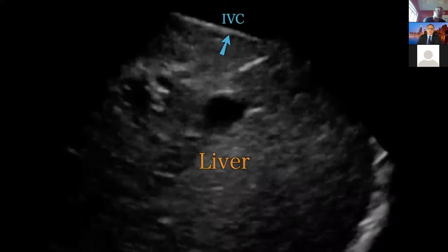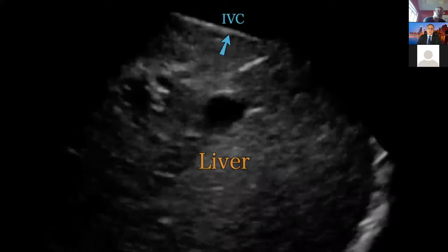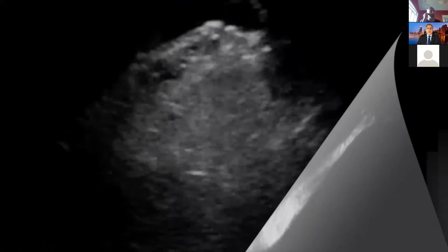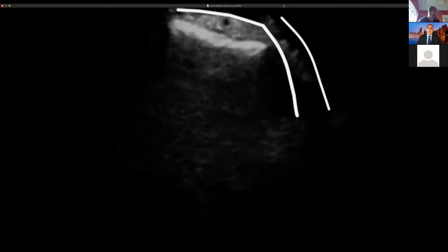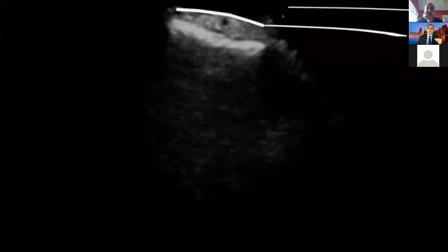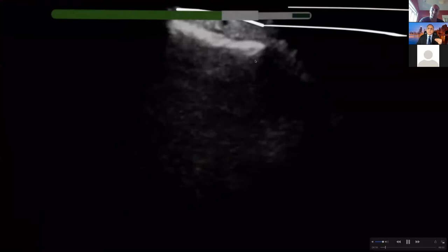You can see the liver and the inferior vena cava. As you're advancing it, you're going to go to the right side of the screen because the legs are on the left side of the screen and the head is on the right. But it is not always easy — sometimes you can see the IVC becoming kind of slanted. If the IVC is getting slanted, I want to dive into that IVC by doing an anterior tilt. When I do the anterior tilt, I get to that area and make it horizontal, because I am now inside that very IVC.